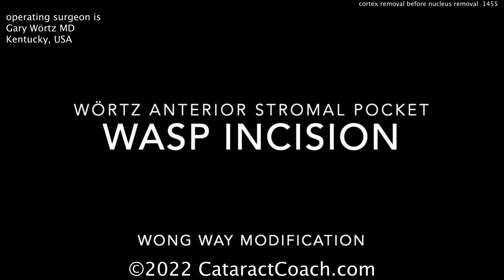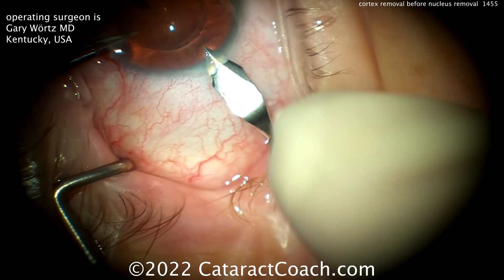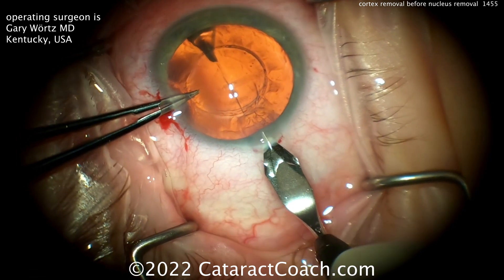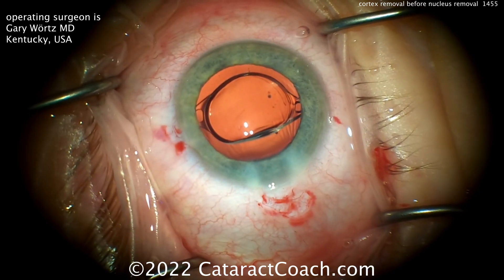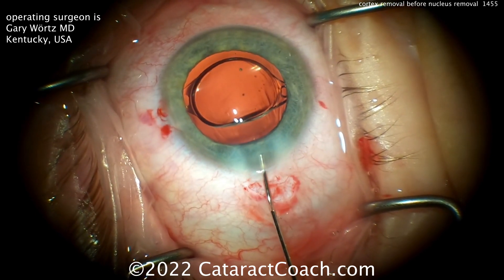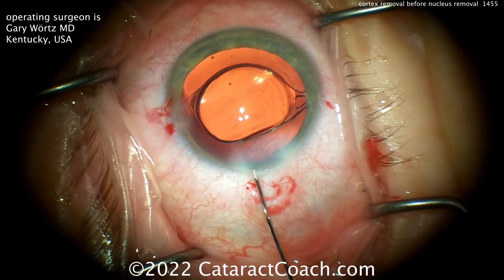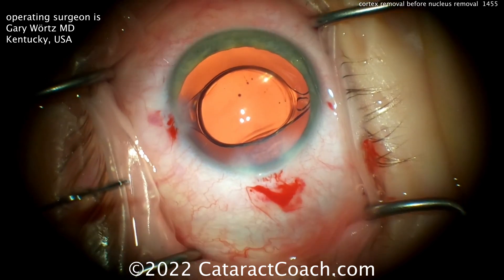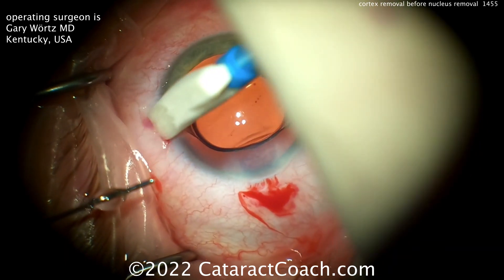This is the anterior stromal pocket incision — a Wong Way modification. As you can see, I'm making my normal limbal incision, but before I take my knife out, I'm making a small anterior stromal pocket in the superior lip of the wound. When I go to close the incision, I'm just doing my stromal hydration into that pocket, and then in both corners of the incision. It creates a very strong seal without an epithelial defect, and I think it's the strongest seal I've ever experienced. I think you'll like it.